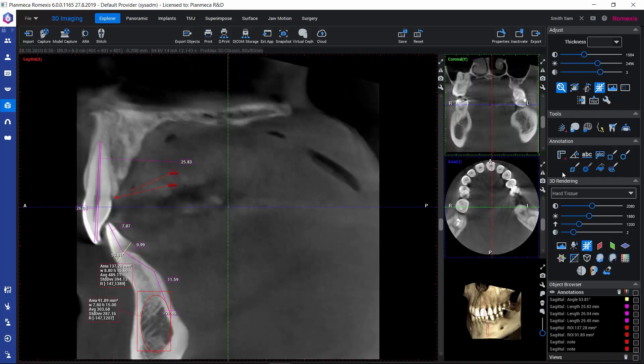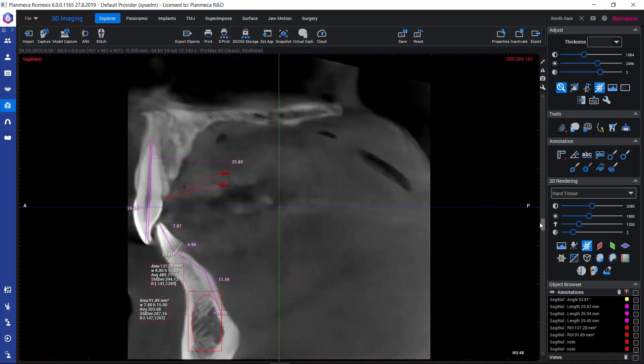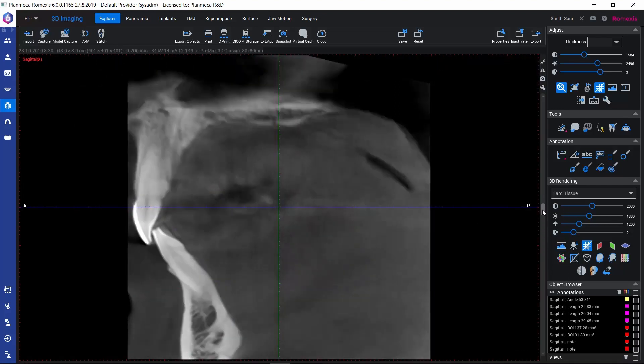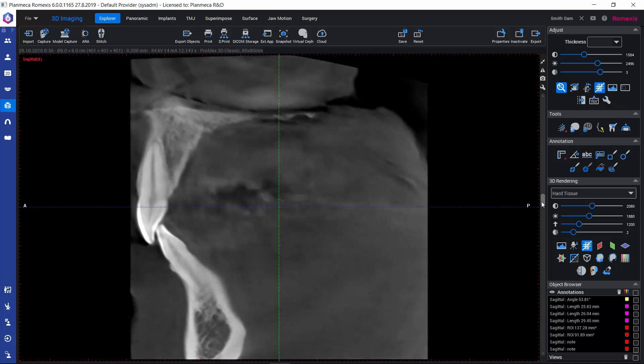Let's take a look at how we can manage our annotations. If we are browsing somewhere in the volume and have lost track of where we made our measurements and annotations, we can navigate back to them.